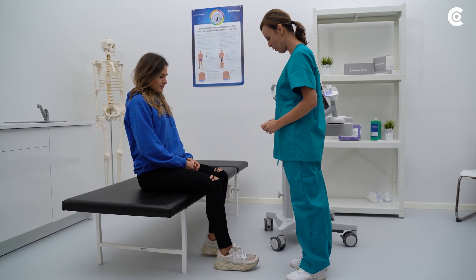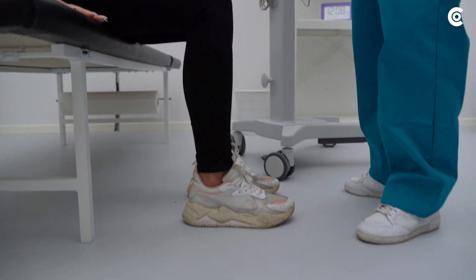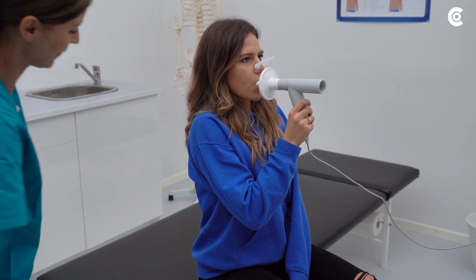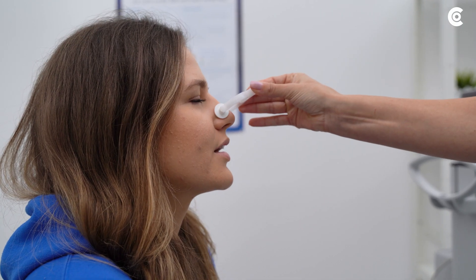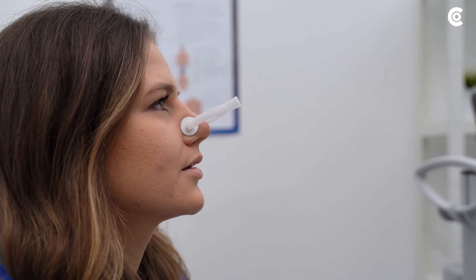Check that the patient is seated in an upright position and make sure that the patient maintains this posture throughout the entire process. Attach the nose clip. When properly attached, no breathing air should escape via the patient's nose.